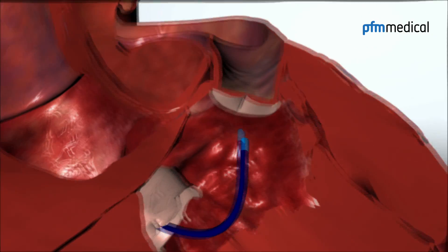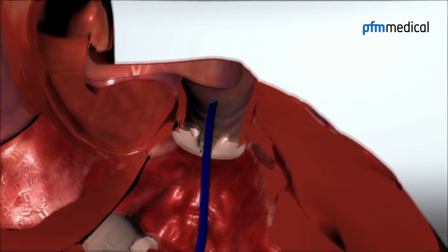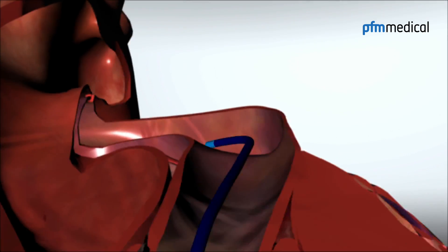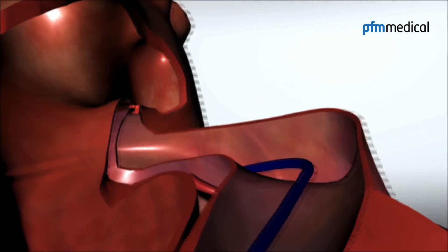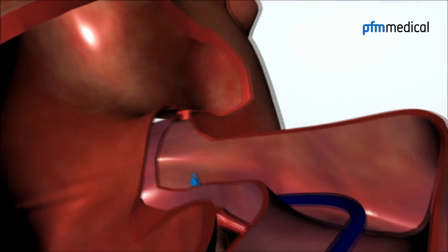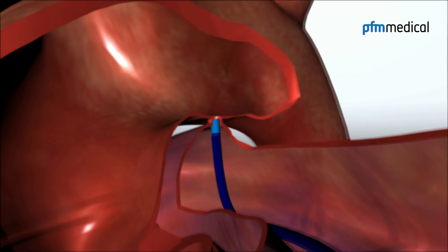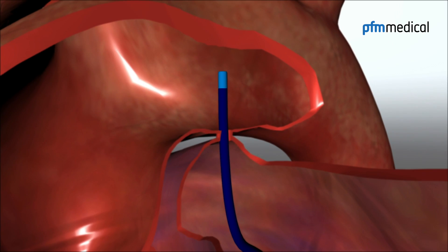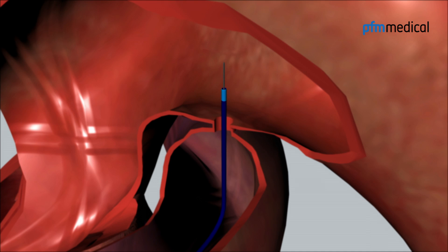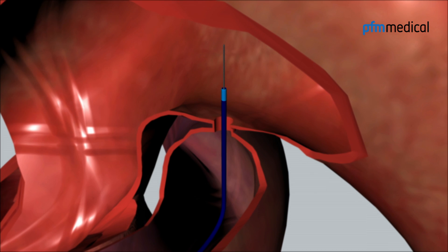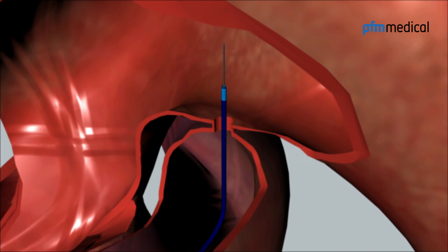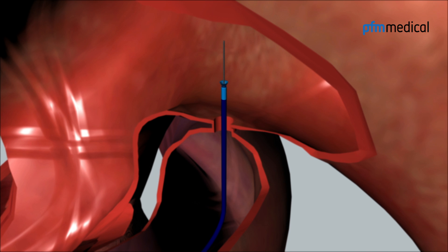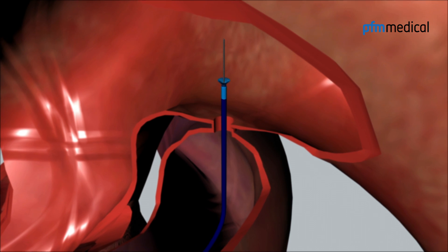An implantation sheath is advanced from the pulmonary artery through the defect and placed in the descending aorta. The occluder is advanced to the distal end of the implantation sheath.